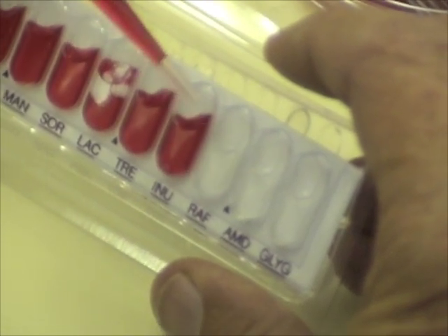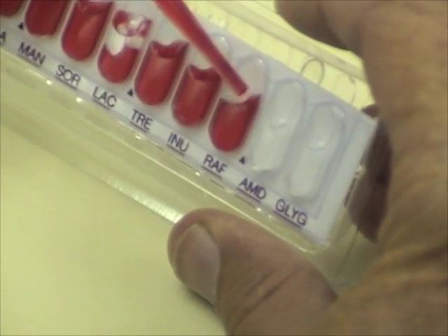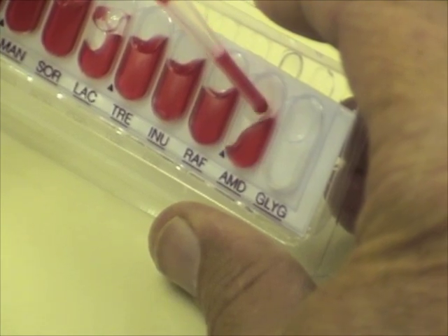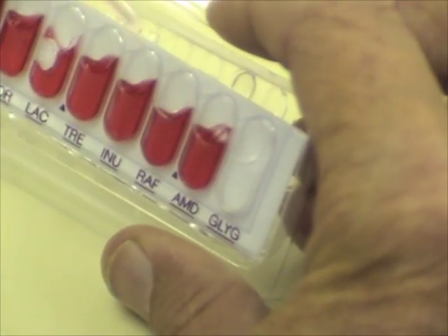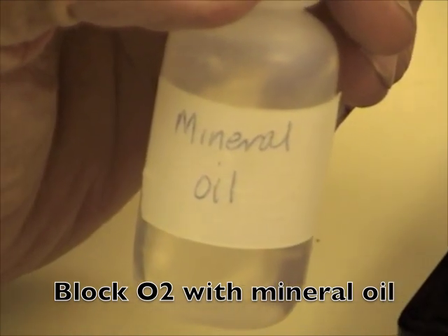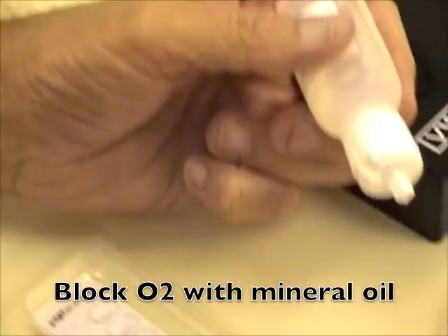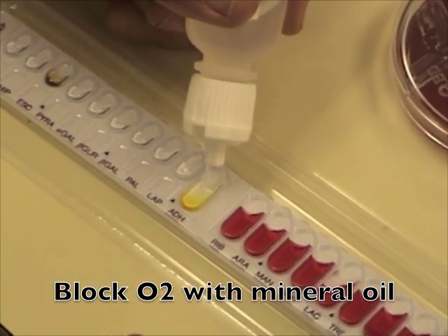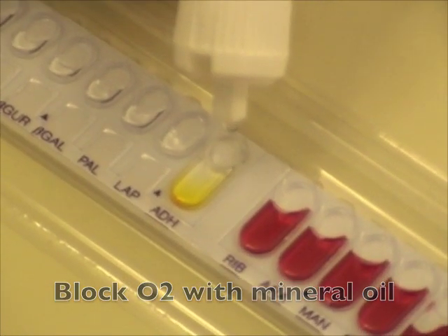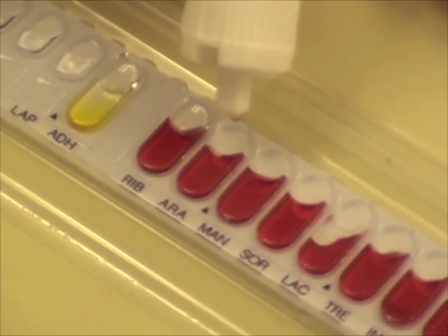There's trehalose, inulin, continuing on to the end: raffinose, and the last. Then we want to get our mineral oil after this and cover it. The mineral oil actually prevents the rapid exchange of oxygen with your media. So you begin with the ADH — in this case you do have that anaerobic as well — and then each of the sugars.